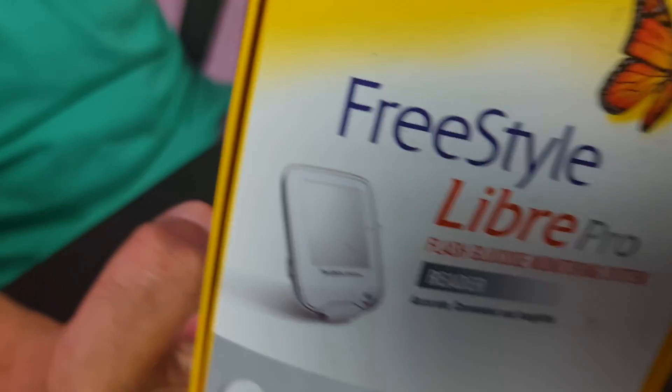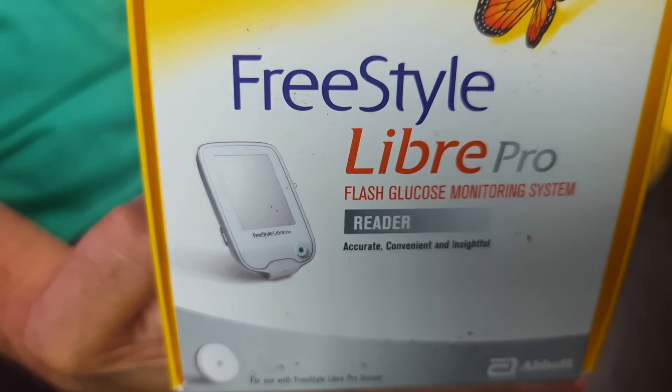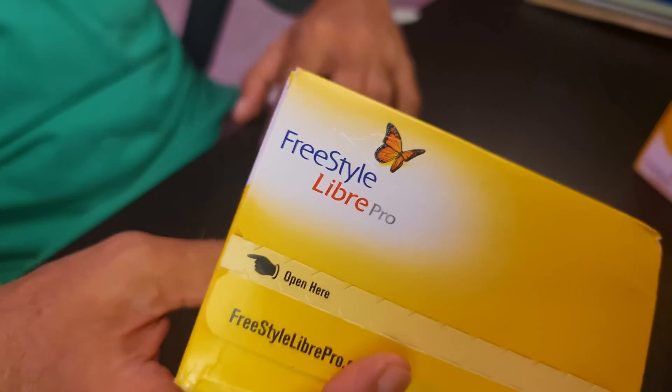Let's go to the unboxing and set it up. I have laid out the packages here. This is the Freestyle Libre Pro reader, used to activate the sensor and collect the readings. This is the Freestyle Libre Pro sensor which will be applied to the arm. I urge you to read the instructions before applying this sensor to your arm.